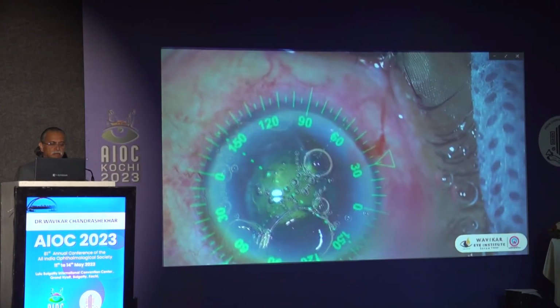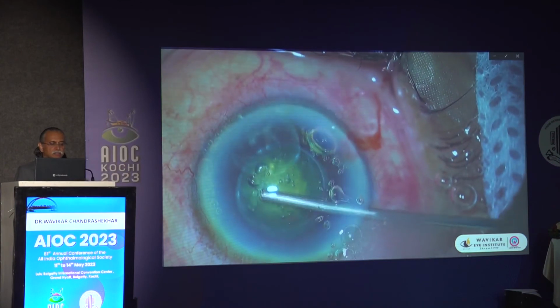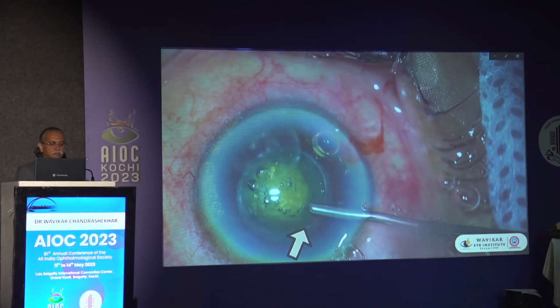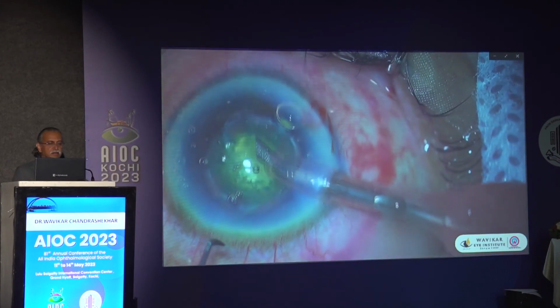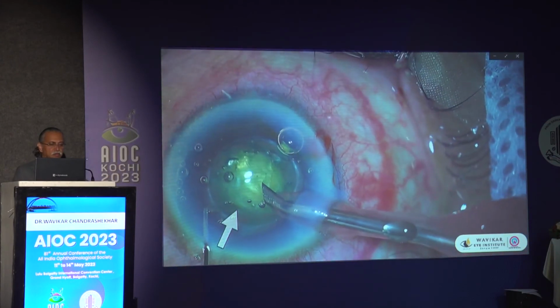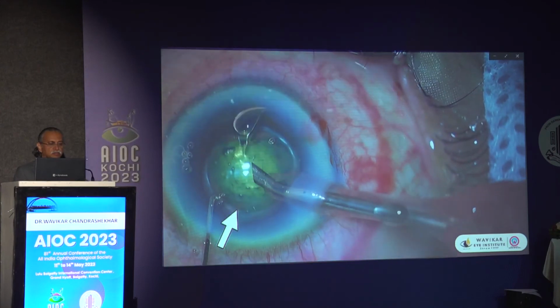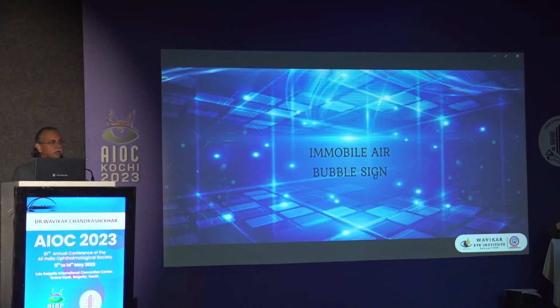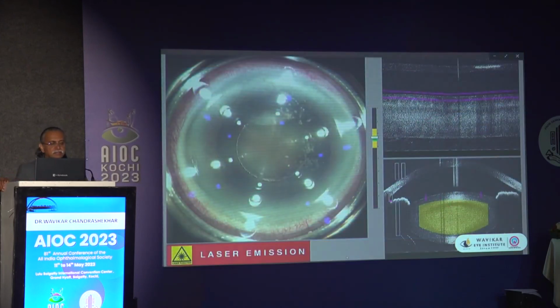Basically, what I had done is that I was doing all the maneuvers above the Descemet's membrane. You can see that the membrane is there. And now I have taken the rexis, and now you can see I am taking another membrane. But it was so crystal clear that I did not have any doubt. Of course, the patient had to go ahead with DSEK.